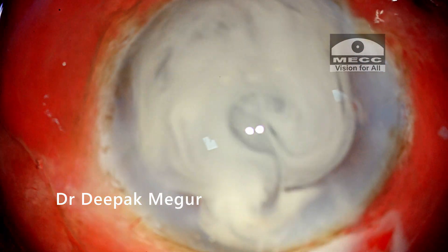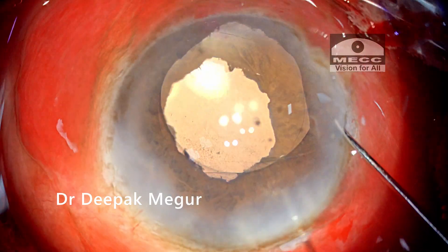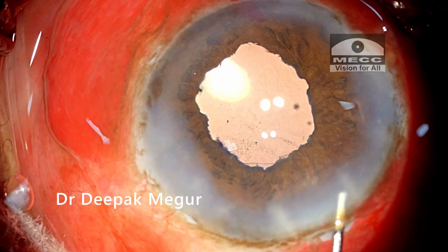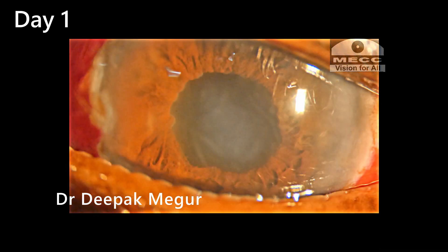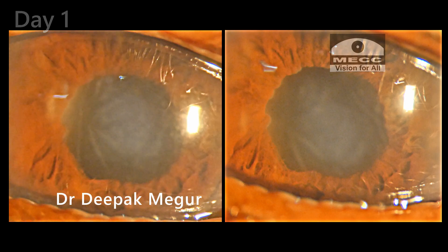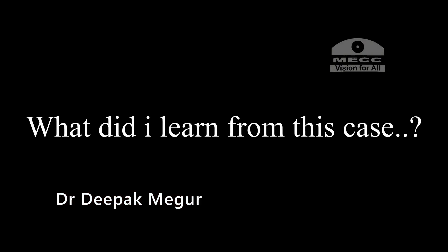Before closing, I use diluted triamcinolone to rule out any vitreous prolapse — and there is none. The side ports and main incision are hydrated and the case is done. The next day the patient has significant corneal edema, likely attributable to the slightly anterior plane of emulsification. Luckily, by day three the cornea clears and the patient has decent postoperative vision.